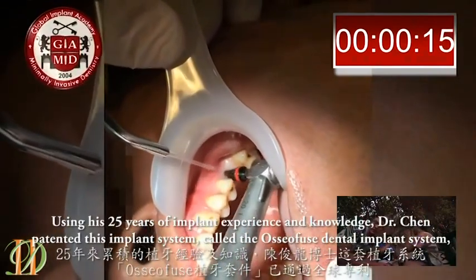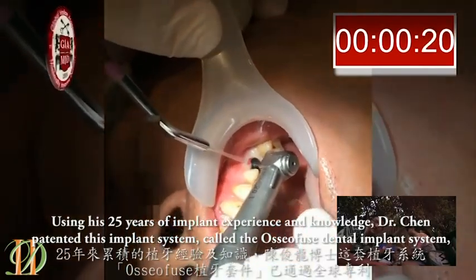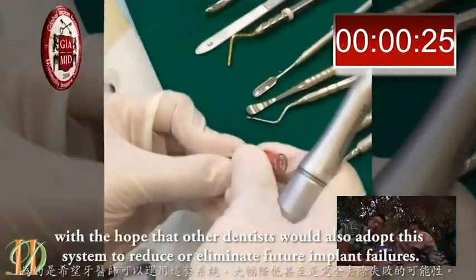Using his 25 years of implant experience and knowledge, Dr. Chen patented this implant system, called the Osseofuse Dental Implant System, with the hope that other dentists would also adopt this system to reduce or eliminate future implant failures.